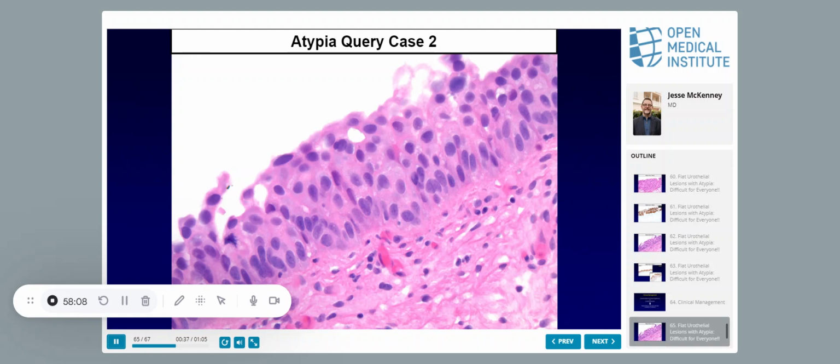You can't have it both ways. You said more times that it's very pink. That's the eosinophilia pattern. Yes, it's unusual. Being highly eosinophilic is a little unusual. But my point is, if you feel like you have to split these, it's the same clinical management. So lumping them doesn't change anything.